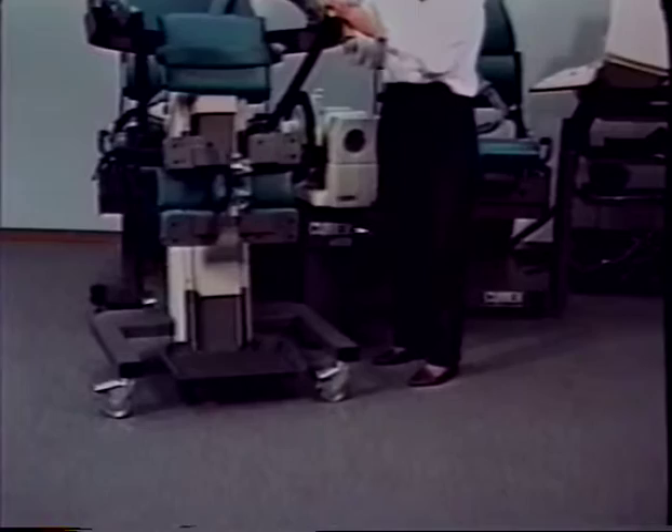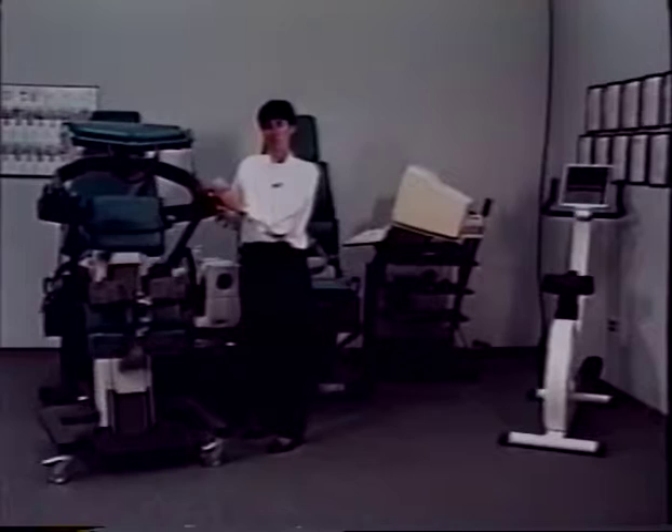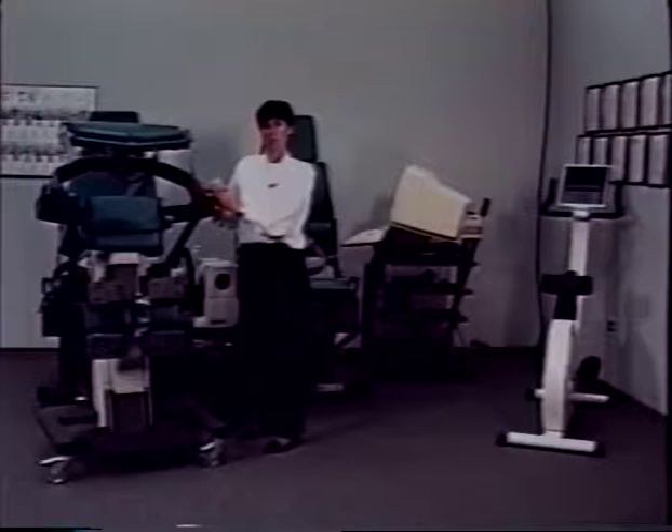The standing position was chosen because it maintains the normal orientation of the spinal curves, especially lumbar lordosis. It reflects functional vertebral positioning and simulates the way muscle groups act together during functional movement, using the muscles which cross the hip in addition to the muscles of the trunk.